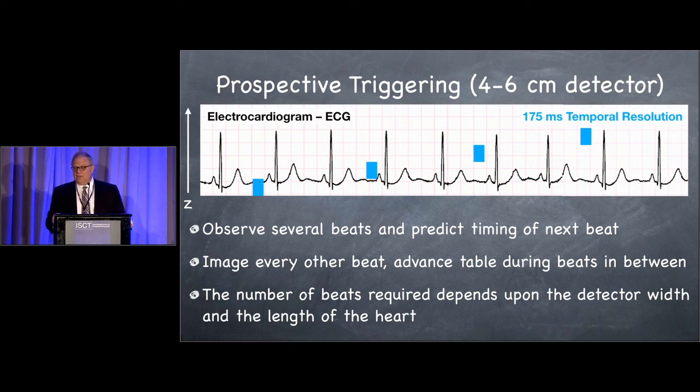centimeter detectors, where basically we acquire a scan, in this particular case modeled in diastole, that covers 1/4 of the heart, and then the table translates during the next beat, and then another scan, table translates, another scan, another scan. So you notice that I'm kind of mixing the z-axis here, the table travel motion, along the ECG tracing here. And so it's these 4 heartbeats that sum up to result in the CT scan.